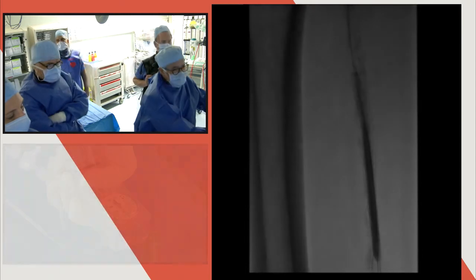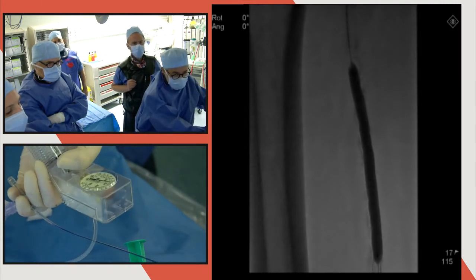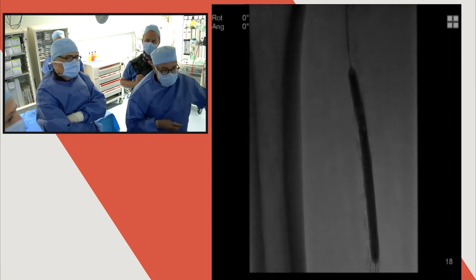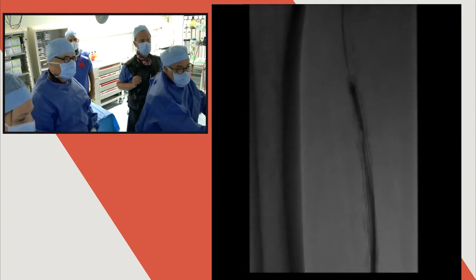We may have to place another stent at the proximal part. We'll see. I hope not. It's done. Usually the Eluvia stent design should guarantee a good opening of the edge, because it's a closed cell stent.